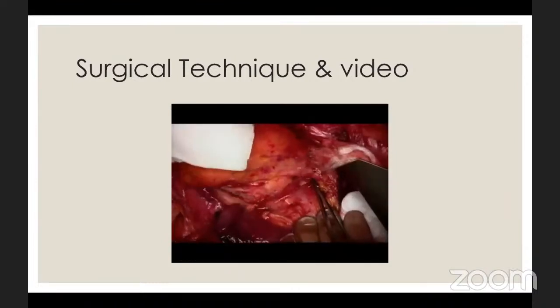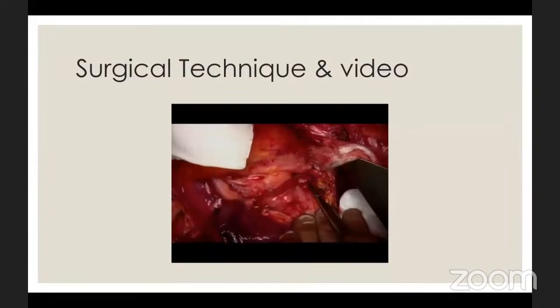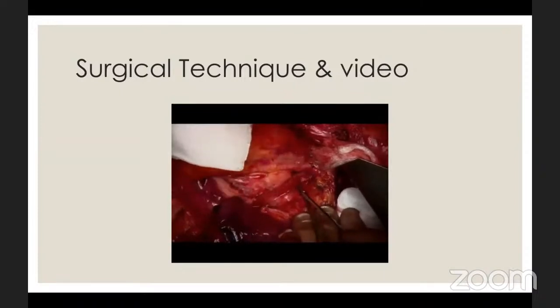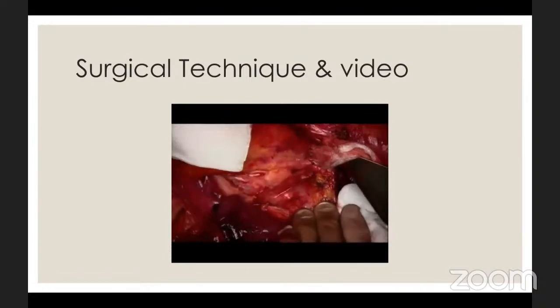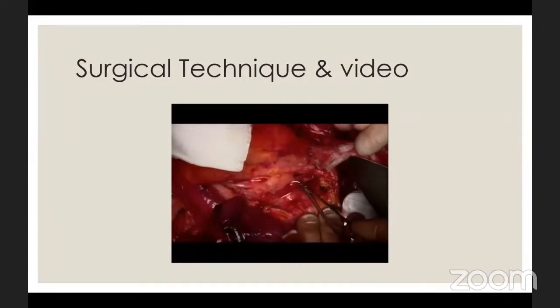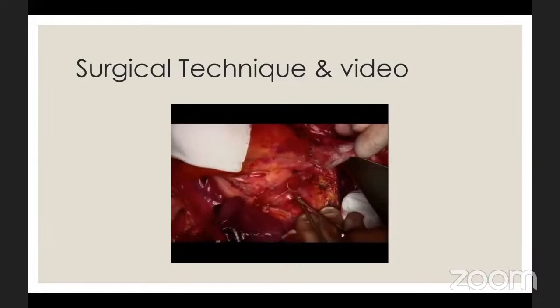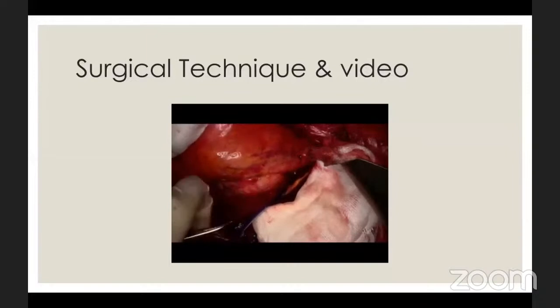For cannulation for the left heart bypass, one can choose between the left atrial appendage, one of the pulmonary veins, or the proximal aorta itself, if the anatomy of the aneurysm allows. Manipulation of the left atrial appendage with forceps or needles may cause rhythm disturbance leading to hemodynamic instability, so some prefer the pulmonary vein for cannulation.